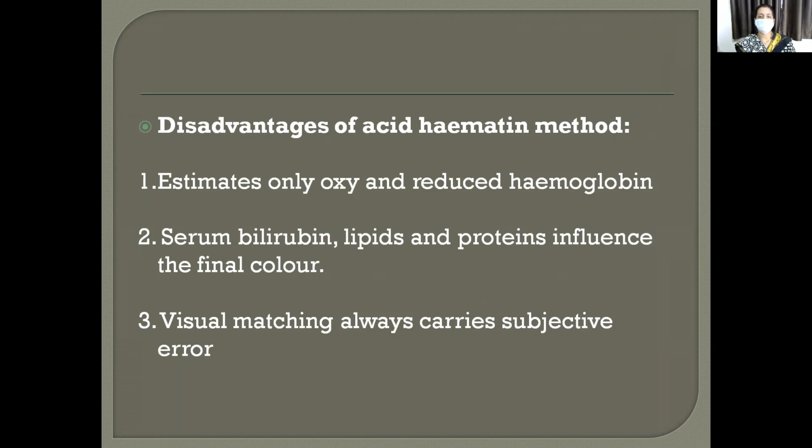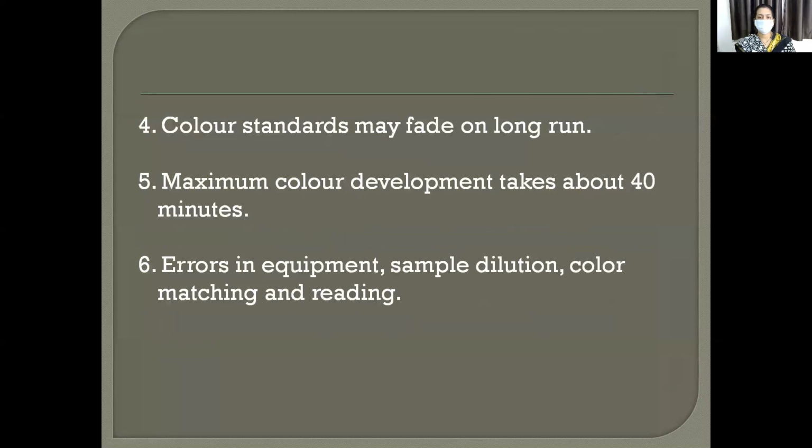I can say that it is 14 grams and you can say that it is 16, according to our visual perception of the color. Color standards may fade, that is the comparator thing. The maximum color development usually takes about 40 minutes, which we usually don't wait. Errors in equipment, sample dilution, color matching and reading can be present.